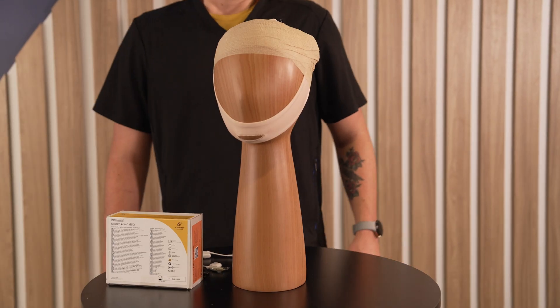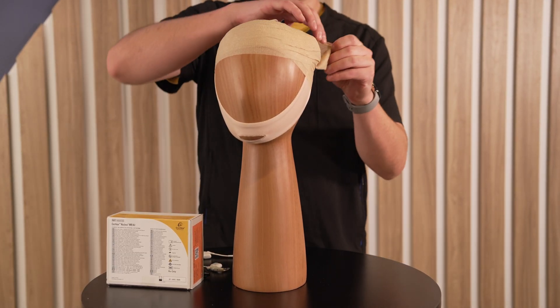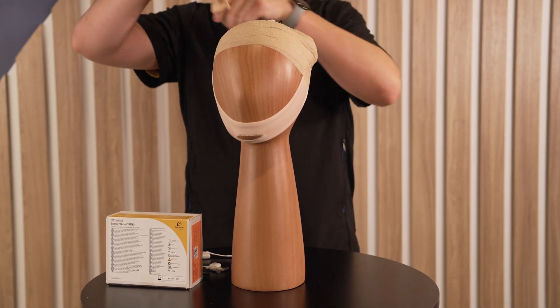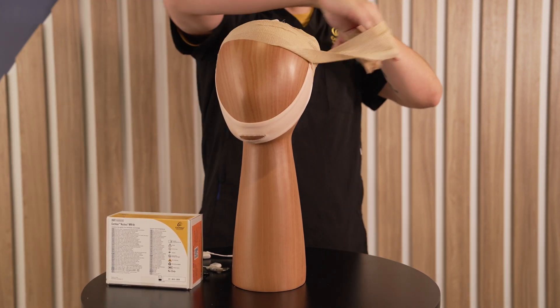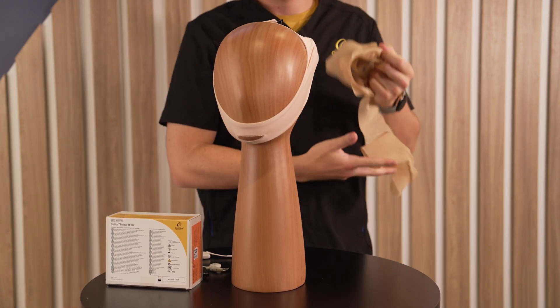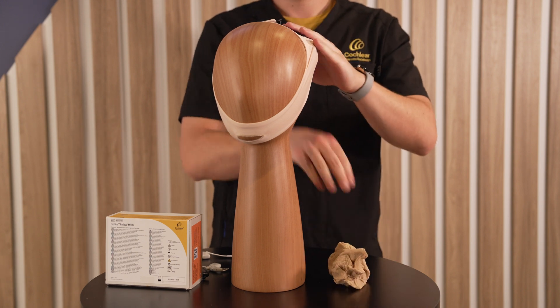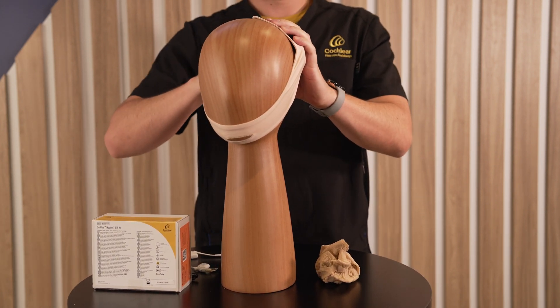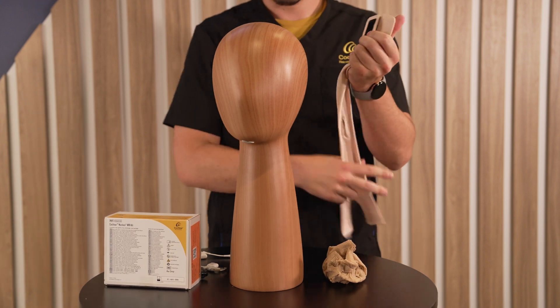Removing the wrap: after the patient has left the MRI room, remove the MRI kit components and ask the patient to put their sound processors back on. Please confirm that placement of the sound processor is correct, that there is no discomfort, that sound is perceived as normal, and if any issues are reported, please ask the patient to seek assistance from their implant clinician as soon as possible.